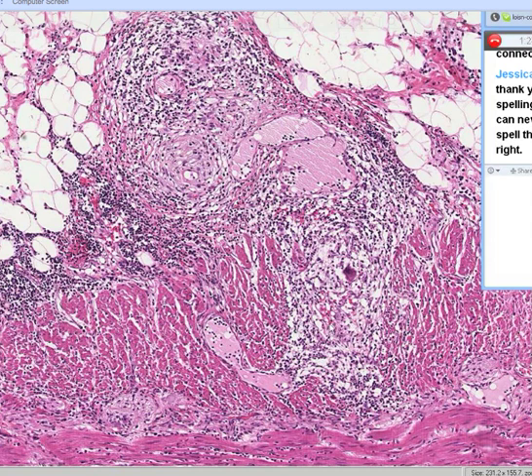Oh, and by the way, can you see over here? Just say yes or no. If you could see these inflammatory cells completely infiltrating the longitudinal muscle layer as well. Good, you can all see it. You can see smooth muscle here, you can see smooth muscle here, and you could see a band of inflammatory cells completely dividing that layer of longitudinal muscle. And the reason why you know this is longitudinal muscle is because it's the outer layer. The outer layer is always longitudinal in the small bowel, and actually in most of the GI system.